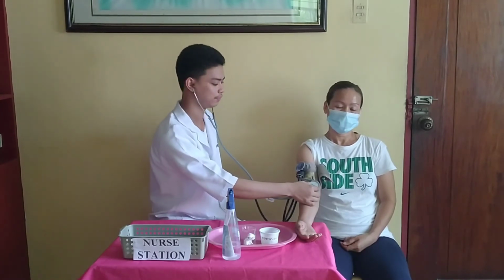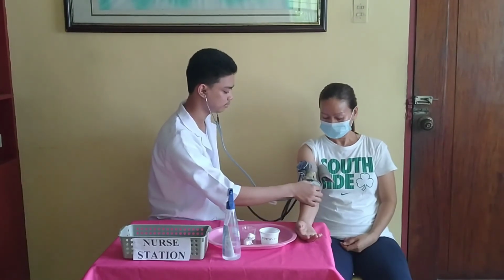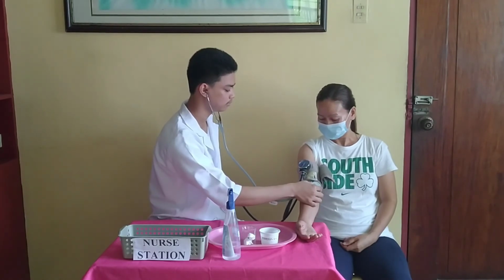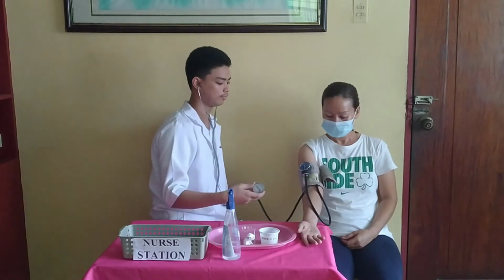Then, auscultate the client's blood pressure. Pump up the cuff until the sphygmomanometer reads 30 millimeters of mercury above the point where the brachial pulse disappeared. Then, release the valve of the cuff carefully so that the pressure decreases at the rate of 2 to 3 millimeters of mercury per second. As the pressure falls, identify the manometer reading, then deflate the cuff rapidly and completely. And when the device has determined the blood pressure reading, note the results.